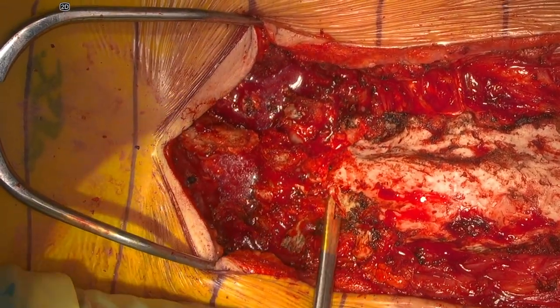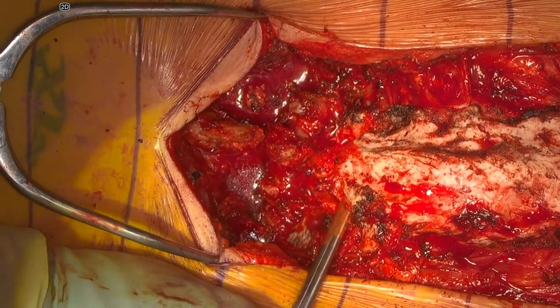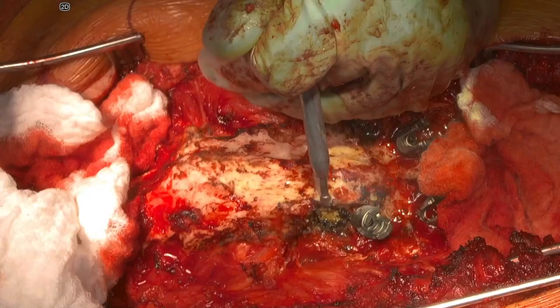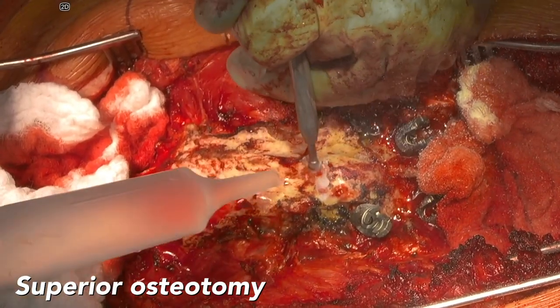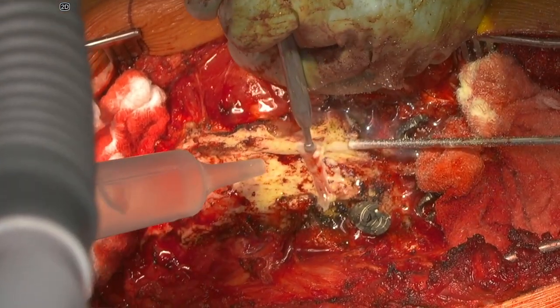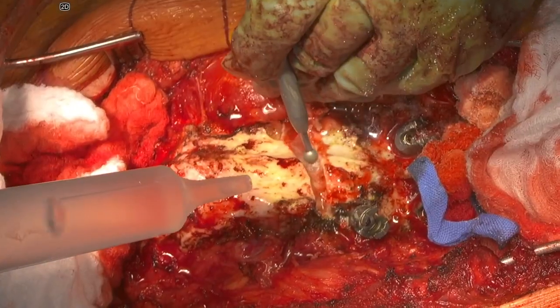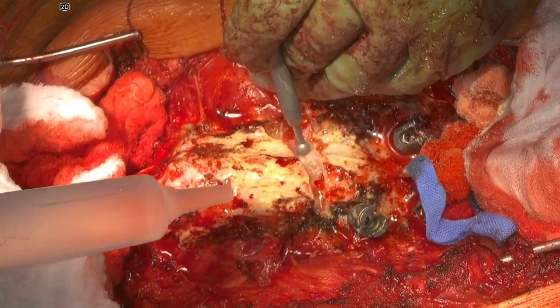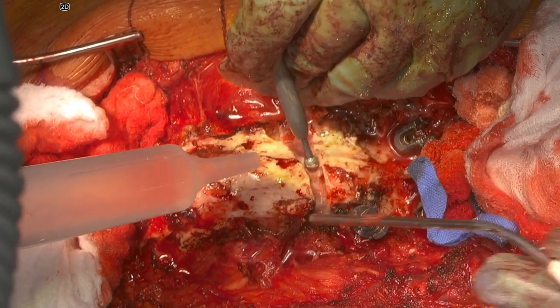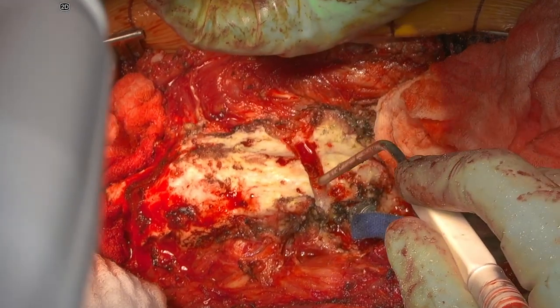A Kerrison rongeur is then used to remove the ligamentum flavum as well as the facet capsule and the facet joint partially, going through the foramen to perform a release of the posterior elements so there is plenty of mobility at the osteotomy site. After all the screws are in the thoracic and lumbar spine, an additional Smith-Peterson osteotomy is performed approximately over the fusion mass. First the aggressive burr is used, then the diamond tip burr is used until the ligamentum flavum. The ligamentum flavum is then removed and the Kerrison rongeur is taken through the foramen.